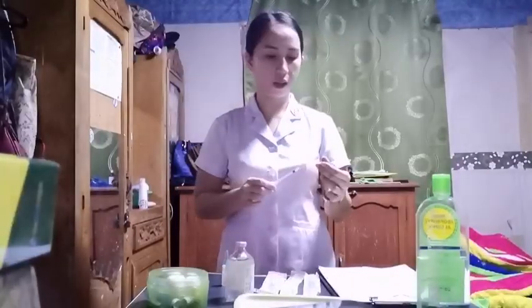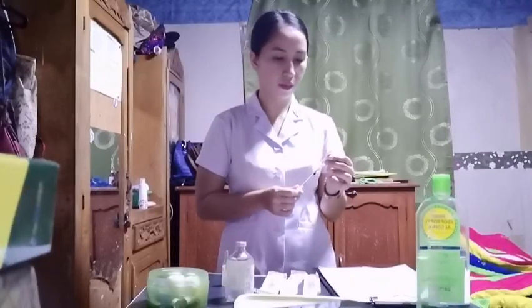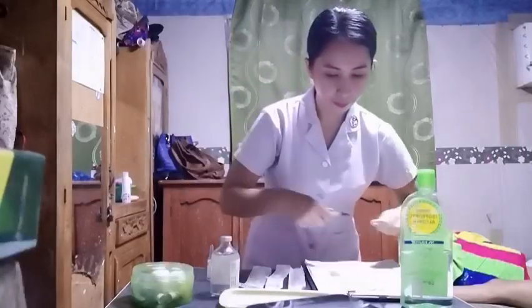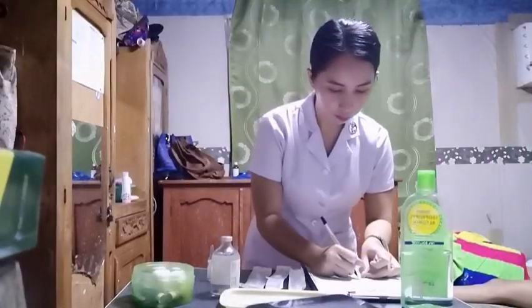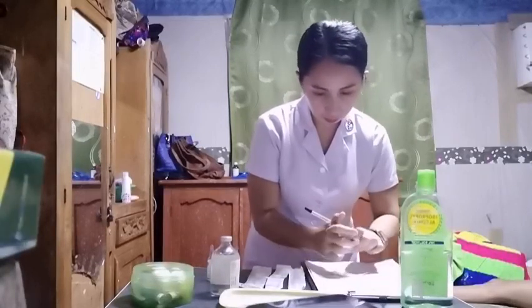Now, there are no bubbles. You need to cap it and place it on a hypodermic tray. And then write the drug name and the dosage on the medication ticket, and place it also on the hypodermic tray.